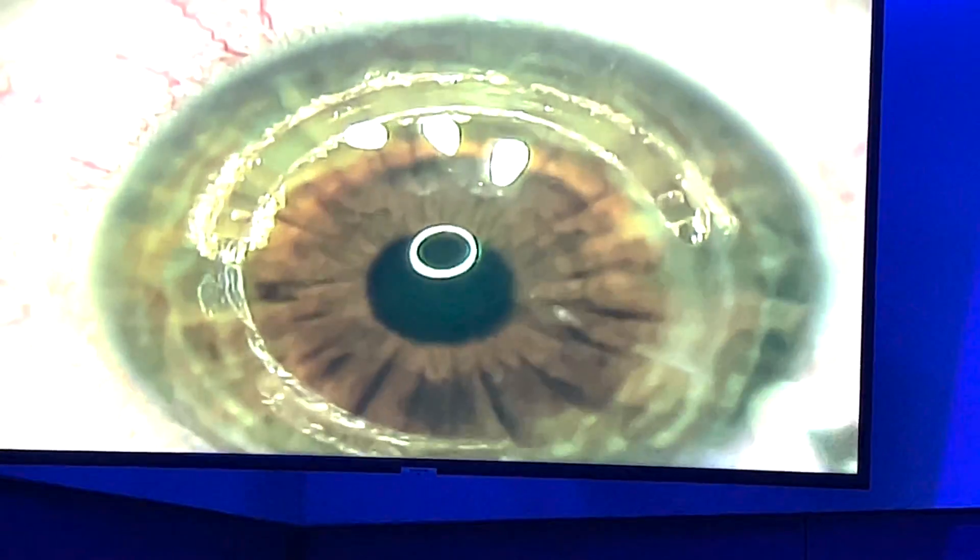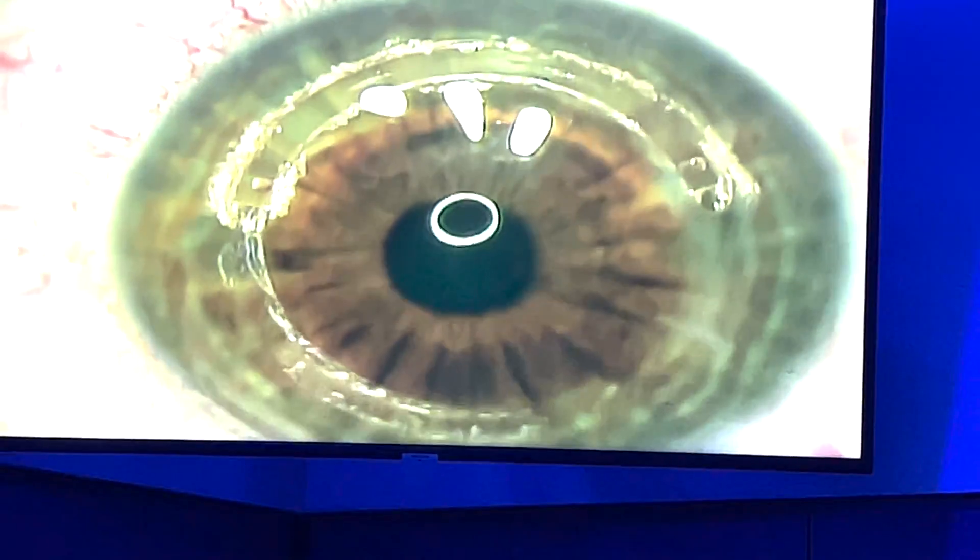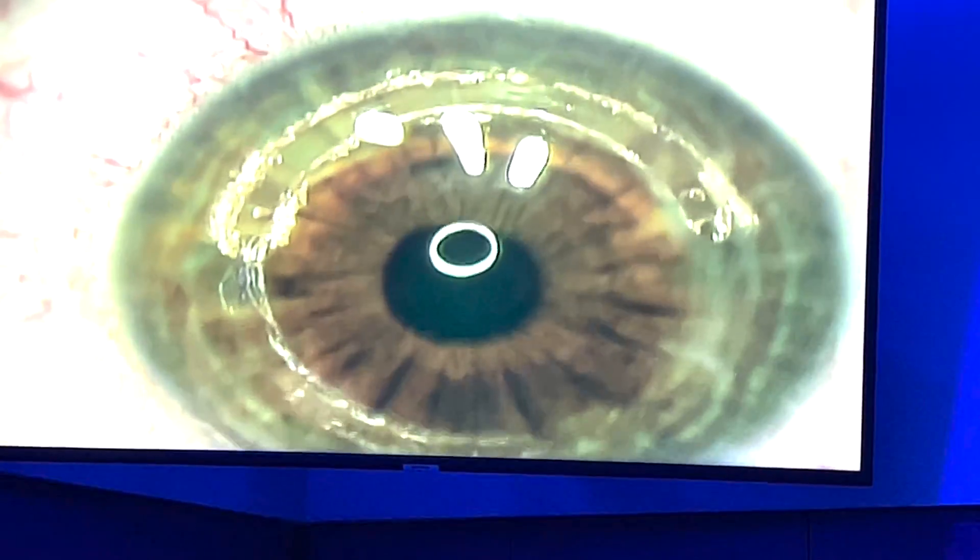We're all done. This is a wonderful gentleman — very advanced keratoconus from RA. Any pain at all? Are you feeling okay?